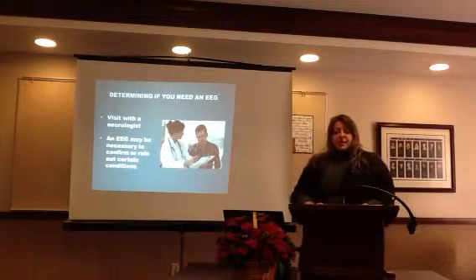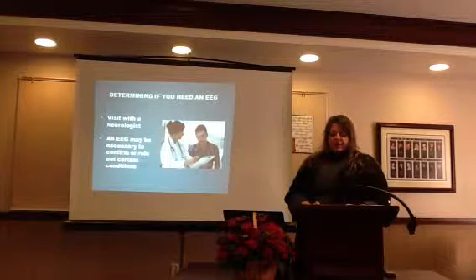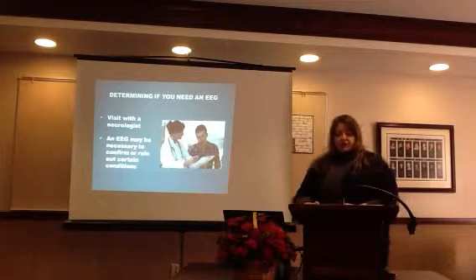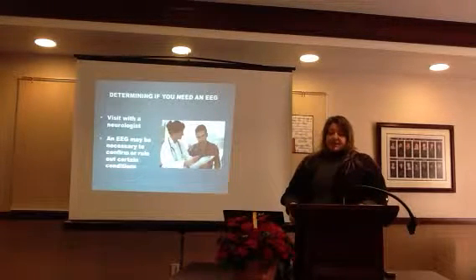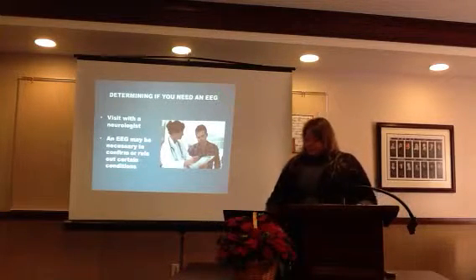The first step in determining whether or not a person might need an EEG is to visit with a doctor who is specially trained to diagnose and treat disorders affecting the nervous system. This kind of doctor is called a neurologist. If the neurologist decides that an EEG is necessary, it can help signify or rule out certain conditions.